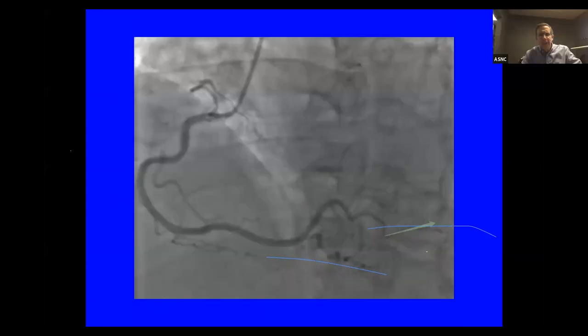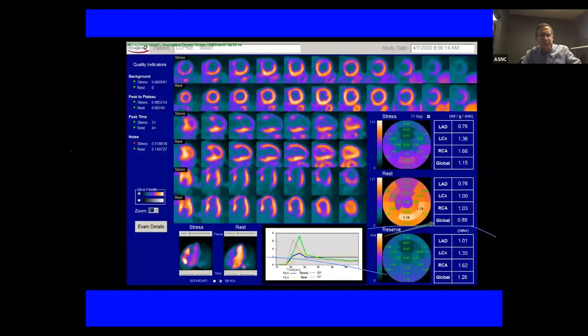So gut uptake is less of a problem with PET than with SPECT. In fact, we're discussing, I didn't get to a case that showed severe gut uptake with SPECT, and one of the solutions was to do a PET study. You have higher resolution, so you can better resolve the gut uptake. Also, this is iterative reconstruction, so you don't tend to get the ramp filter artifact in quite the same way. It's an uncommon problem with PET because of the higher and better spatial resolution.